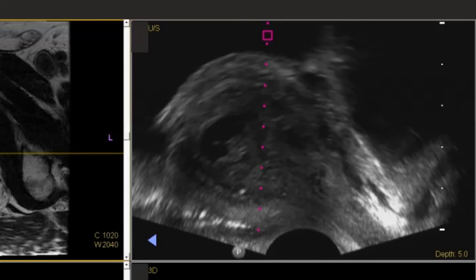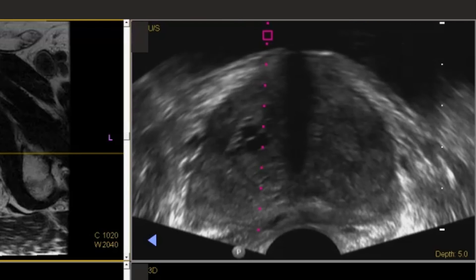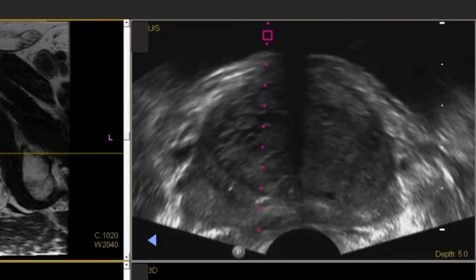Next I will take my measurements of the prostate. We take a length of the prostate in the sagittal view, and then we switch to transverse and take the width, height, and anterior-posterior height of the prostate. Typically we do this in the mid-gland where the prostate is the largest, and this will give us a calculated prostate volume.